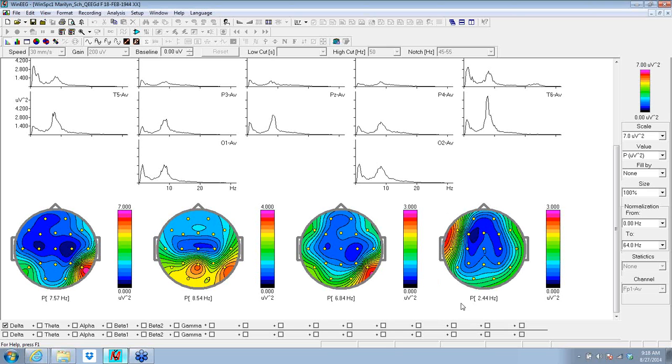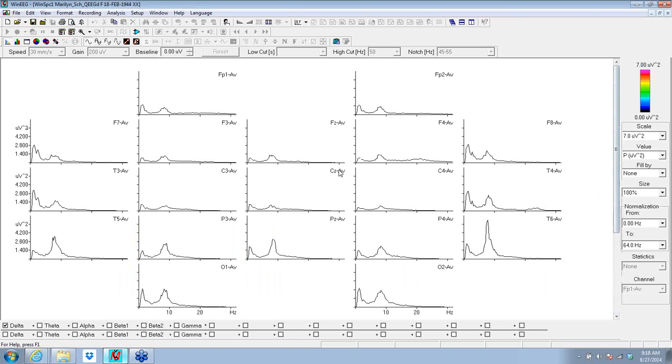These are slow events in the temporal area associated with cerebrovascular insufficiency. Now, if you didn't have the experience to say, oh, that's cerebrovascular insufficiency when you see the pattern, don't be terribly surprised. You have to have the experience to see it, but you also have to have the licensure to be able to call that. And working with a neurologist or electroencephalographer to sign off on your raw EEGs is sometimes quite useful to take care of some of these medically significant features like this.